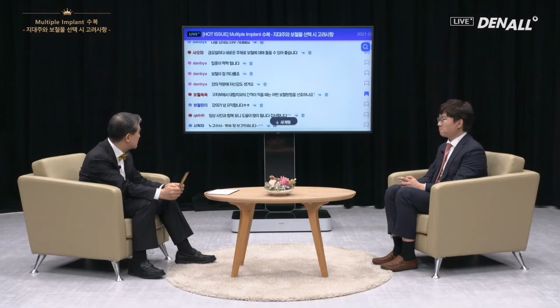For multiple implants regarding the occlusion, custom abutments are used, as I explained before. For multiple implants, if the case has a severe gingival recession and implants are placed with some distance apart and a one-piece prosthesis is designed, depending on the implant path, a combination prosthesis would be difficult to remove, so multi-unit abutments are used. For ease of maintenance, that is used, and recently for immediate loading, that is used too. Thank you for the good answer.